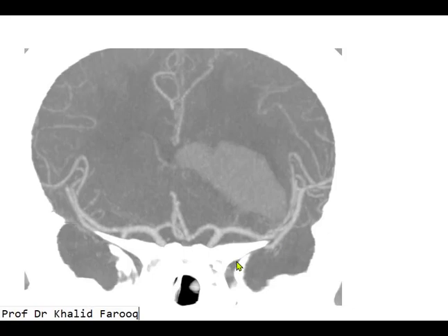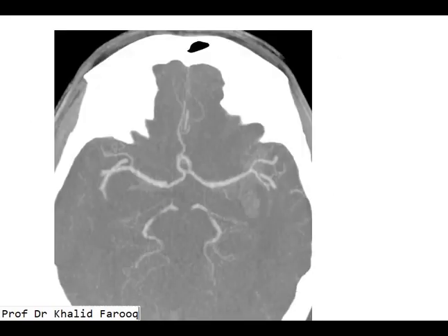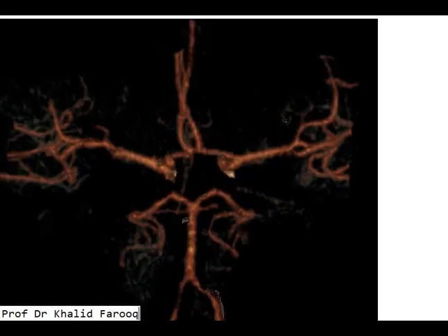Here we can see the MIP images. This is the supraclinoid portion of the internal carotid arteries, and here we have the anterior cerebral arteries and middle cerebral arteries on both sides, and the posterior cerebral arteries on either side — anterior and middle cerebral arteries.